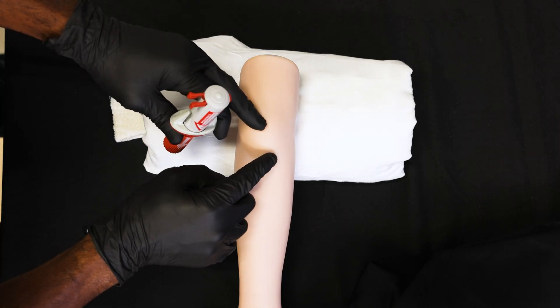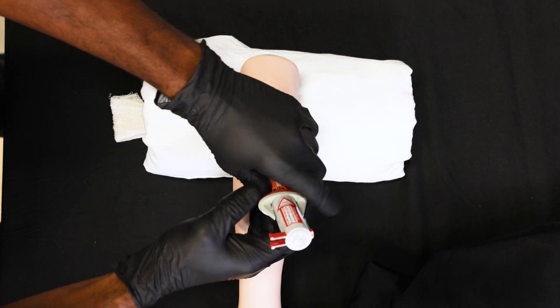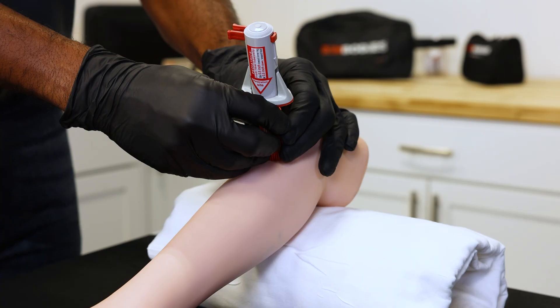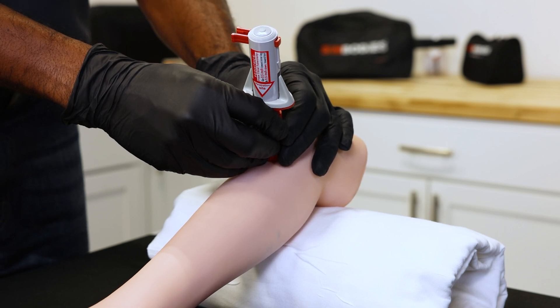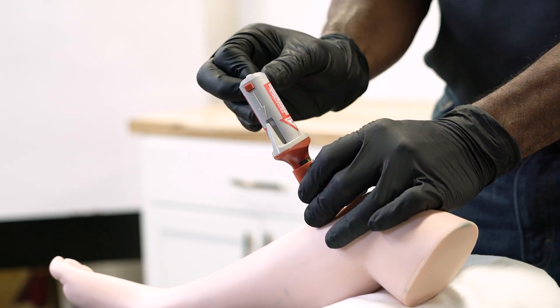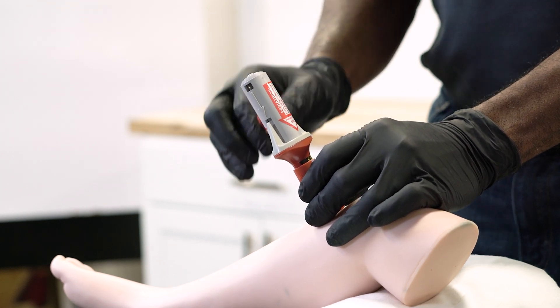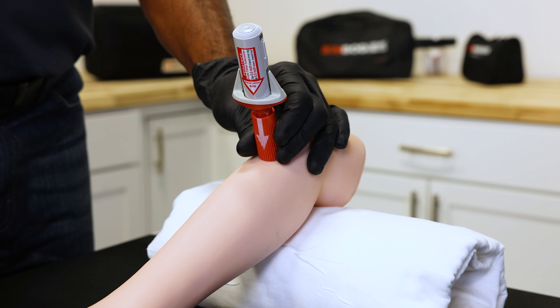With the red end of the Big P against the skin at a 90-degree angle with the arrow pointing towards the leg, stabilize the device by holding the red barrel between your index and ring fingers. Then squeeze and pull to remove the red safety latch from the top of the device and set it aside.